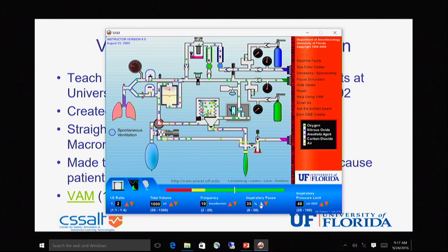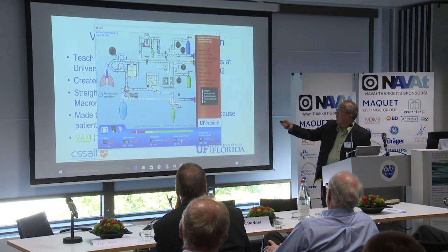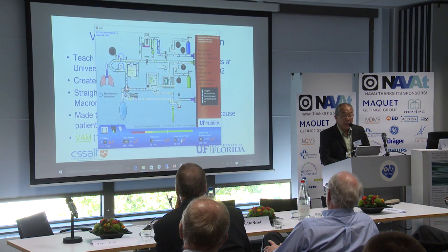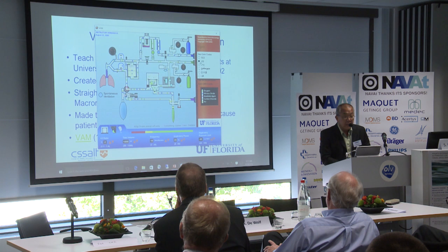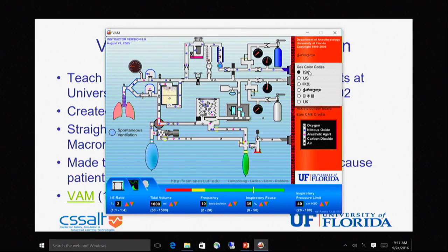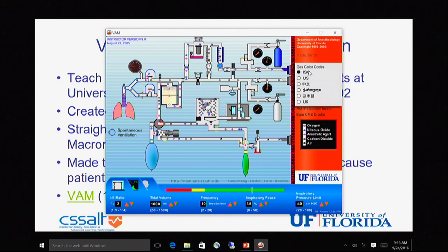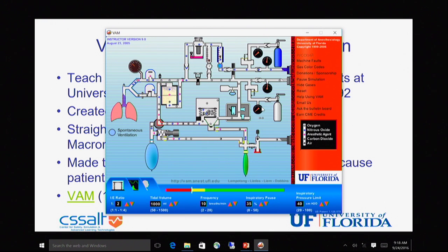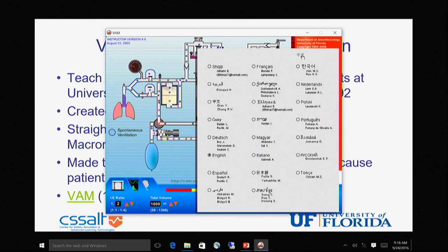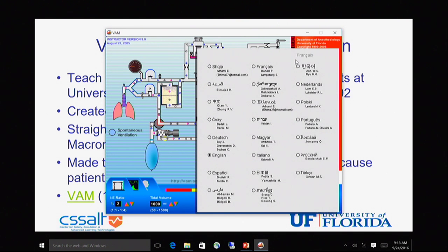The gases are color-coded and represented by little color-coded molecules. Since we're in Europe, let's do it the right way and use ISO. There are six different gas color codes available. Now we are in ISO. There are also 23 languages, and all these translations were done by native anesthesiologists — we politely declined offers from non-anesthesiologists because we wanted domain experts to translate. This was all done pro bono.